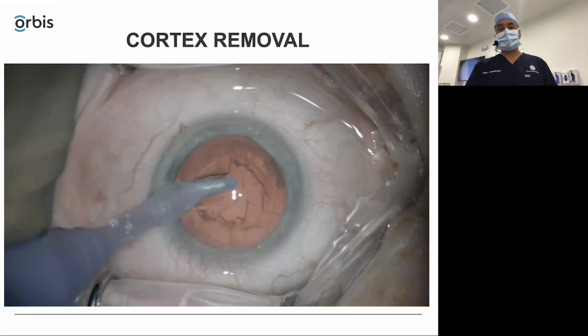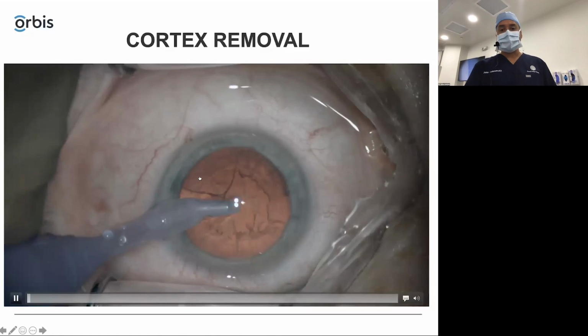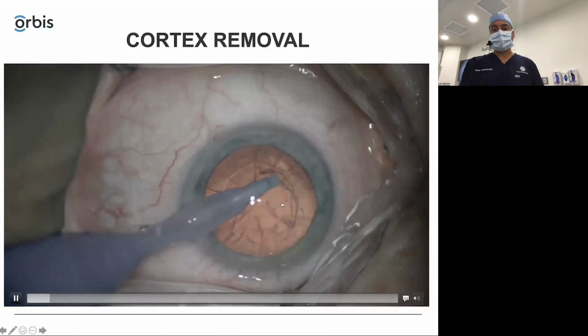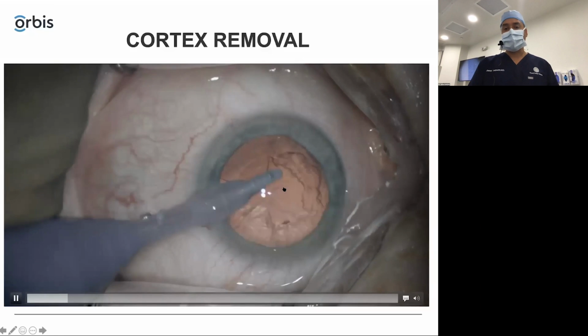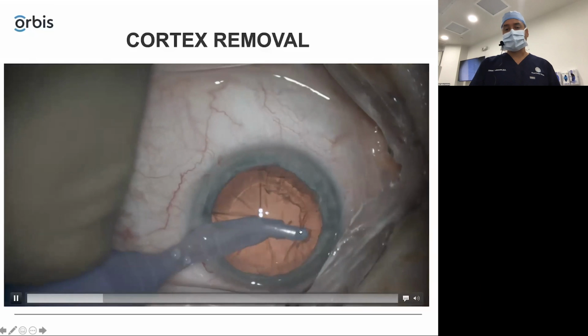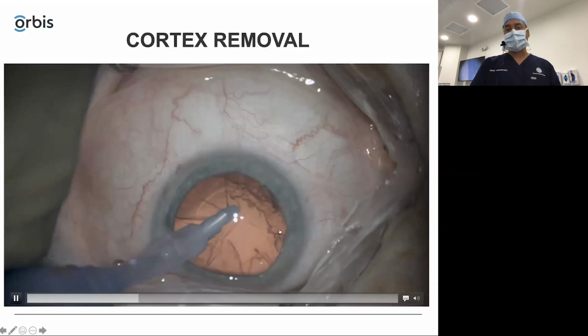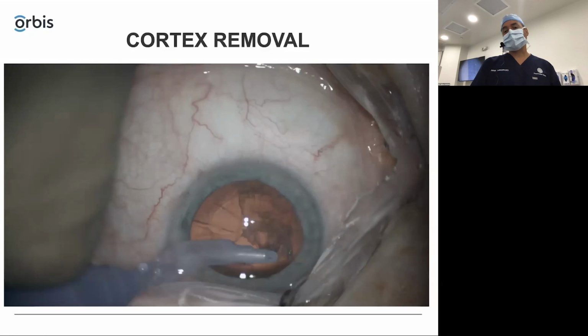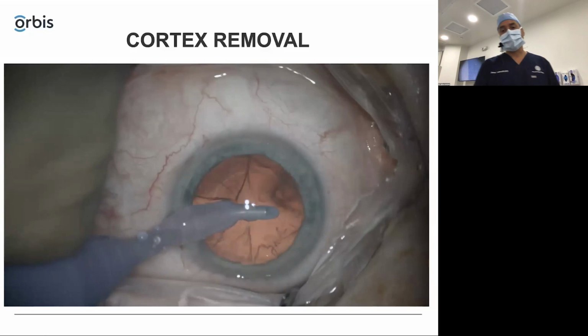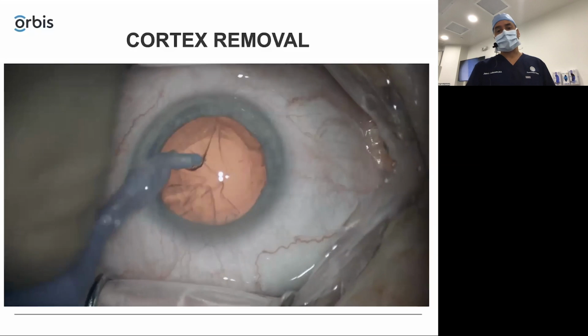This has to do with cortex removal. Let's go back there. Sorry, a little video. And so here we're using INA. Now there's different kinds of INA tips. I use a metal INA tip now. This is a silicone one where you can be a little more aggressive. But as we know, you want to basically catch a tag and bring it to the center and remove it. Sometimes it's thicker than other times, sometimes it's thinner, but the bottom line is keeping that tip away from the posterior capsule because we don't want to cause a tear.